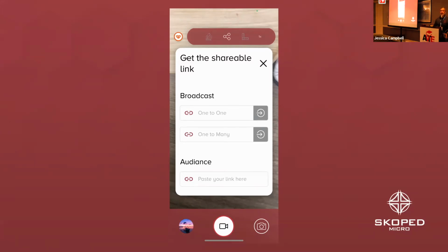I'll come back to you in a second. What I'm seeing now is a lot of slide scanners coming out where they're doing the whole slide, but there's a lot of groups that are going to just individual pictures and videos. As a matter of fact, I've got a meeting with one at 1 o'clock today about how we're going to do this together. I don't know how many Facebookers we have here, but there's a Facebook group called the Digital Pathology Schoolhouse, which is Kate Baker's site.